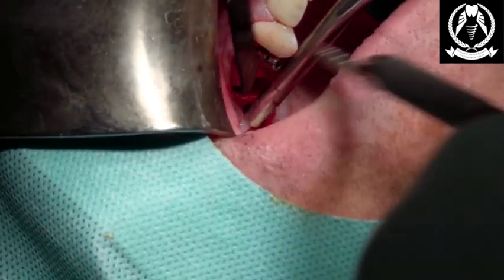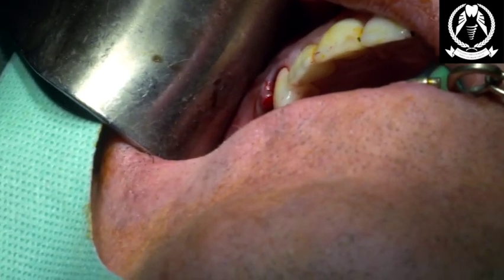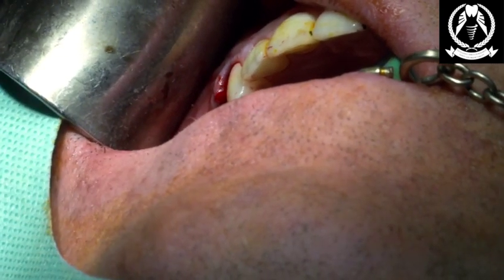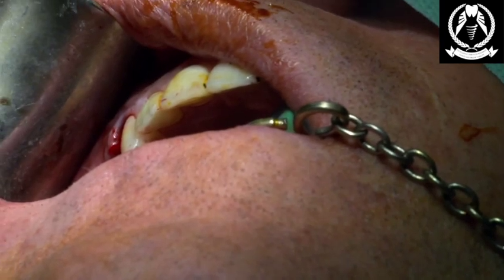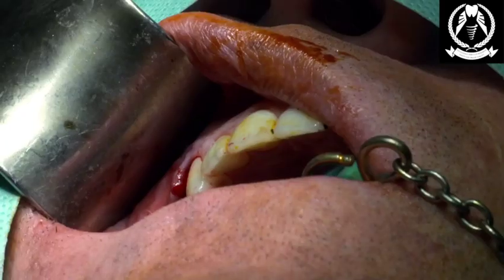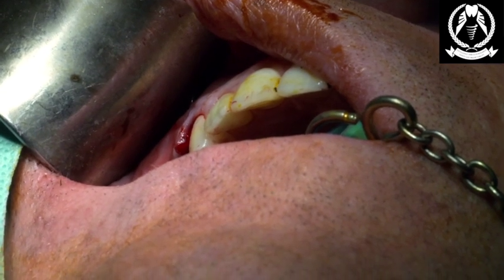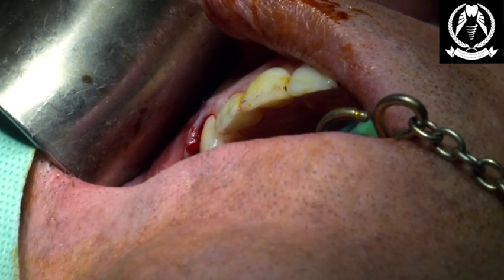Yep, 4.5 by 10. Okay, one second. Let me check a 4.3. Okay, just checking depth. Just get a 10 stopper. Easiest way. Okay. Have a wee little feel. Open, Alan. Sorry, Alan. That's no perforations. That's absolutely spot on what I wanted.